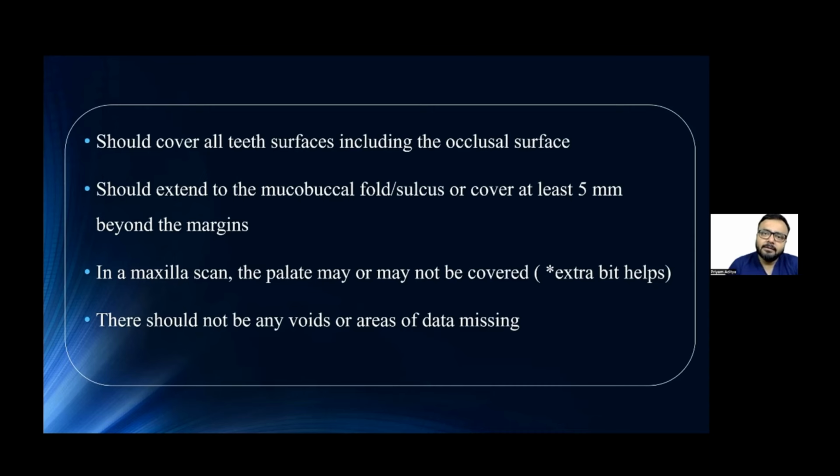In a maxilla scan, palate, many times we don't take it for crown and bridge, but if you're looking into implants, you should cover the palate. Sometimes we do superimpose data just by using palate as the reference point, especially if you are doing pre-ops and you're merging with the preps, palate is the reference point and nowhere else. So do cover your palate if you're using pre-ops, wax-ups, or if you're doing maxilla implant work. An extra bit of data doesn't harm you. You never know, it's going to be helpful to you.